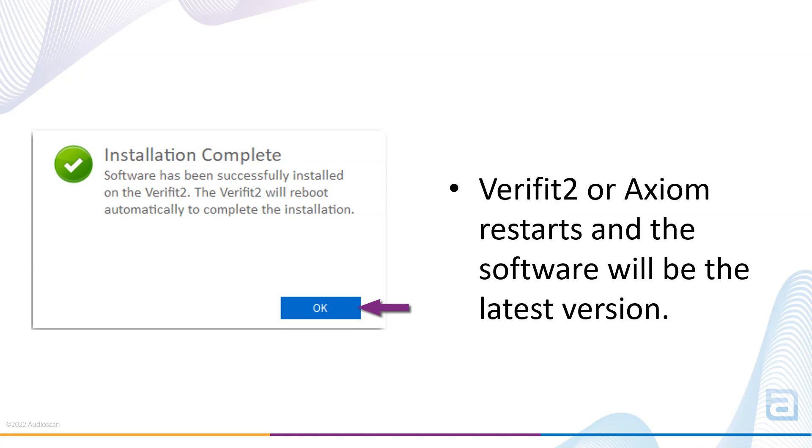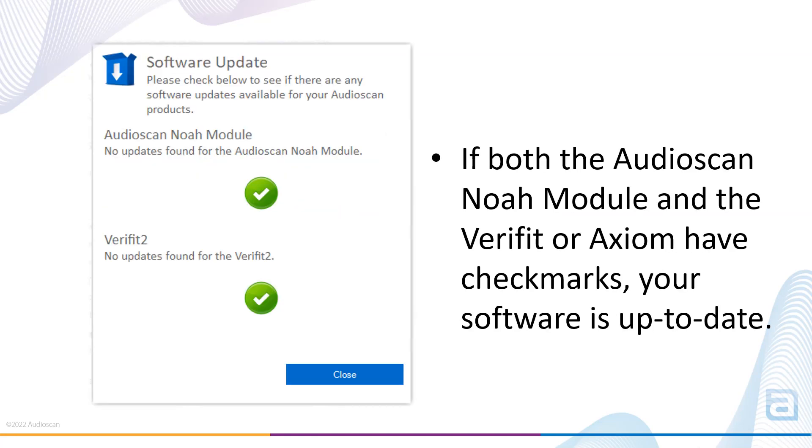Once both the Audioscan Noah module and Verifit 2 or Axiom software is up to date, both will display check marks.